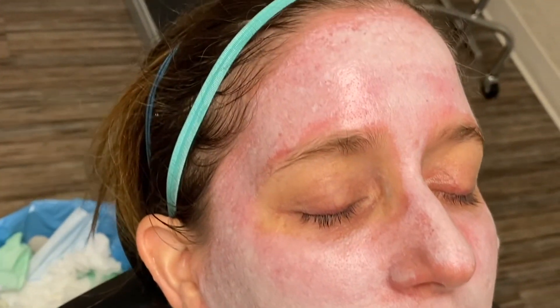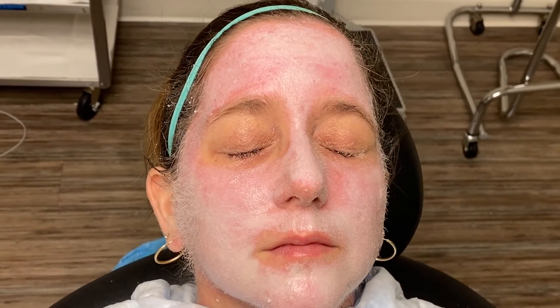So now our chemical peel is over. You can see there's pretty confluent frosting all around, which is the endpoint that we're looking for. The patient's comfortable now after the ice and the fan. We actually give patients this Aquaphor to go home with, and that's really all they should be putting on their skin for the next week or so as they start to peel. The frosting and whitening of the skin should go down in about a couple of hours. We will see our patient in a week.